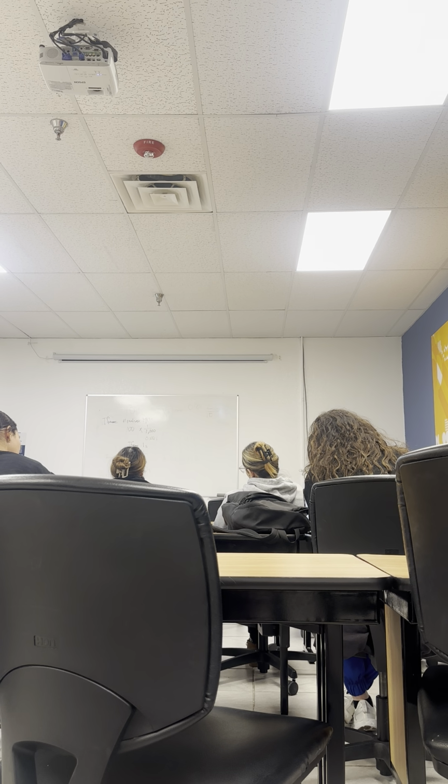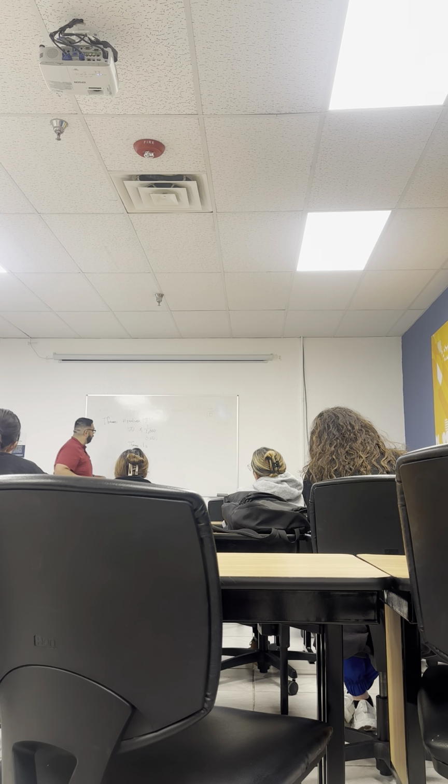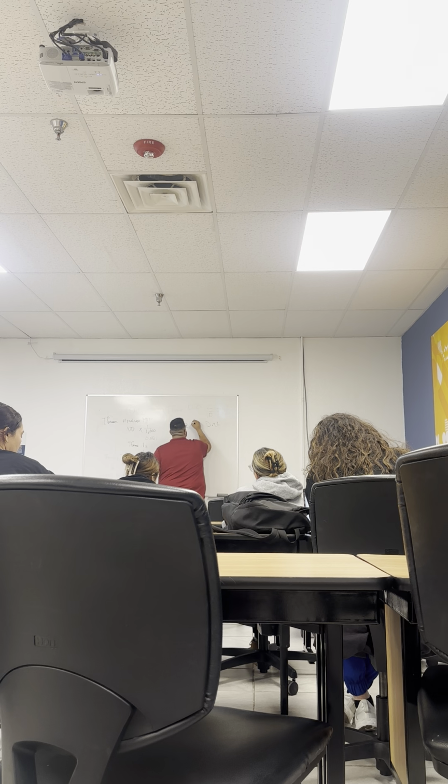Okay, now, what relationship do frame rate and depth have? They're inversely related, right? So frame rate and distance are inversely related.